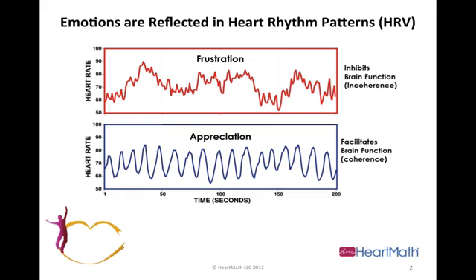So when your clients feel the change and then see the change, it really wakes them up to the fact that they can self-regulate and self-soothe and manage their emotional responses to things. Also, not to go into it much, but these heart rhythm changes have a major impact on our physiology, including brain function.